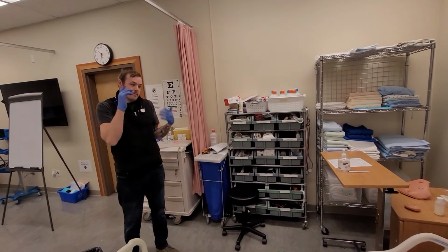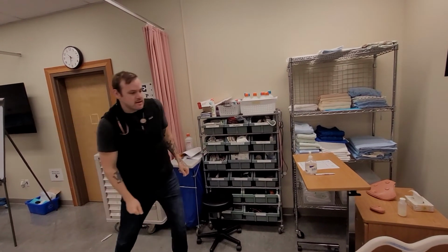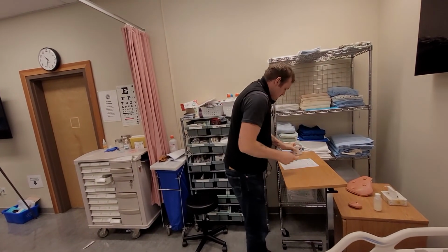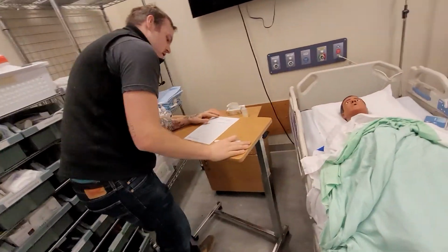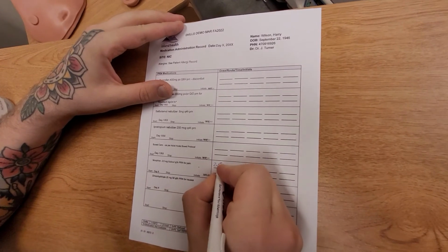Oh, obviously you have to do some documentation for that. So on our MAR here, I've just given the medication. We're going to do 2.5 milligrams.